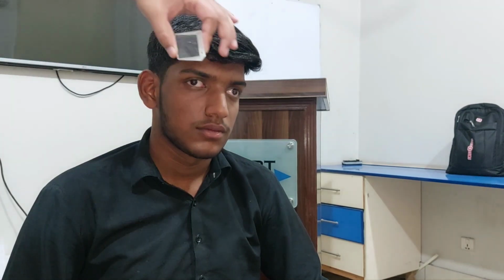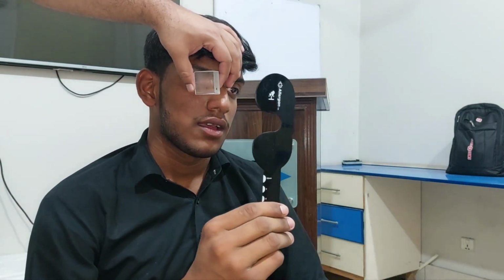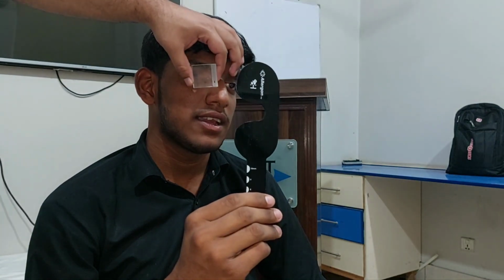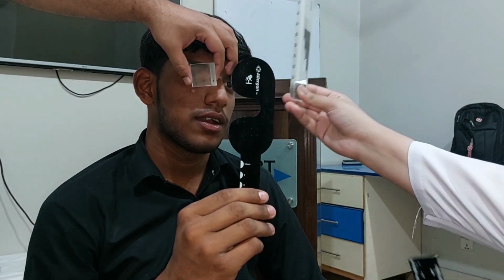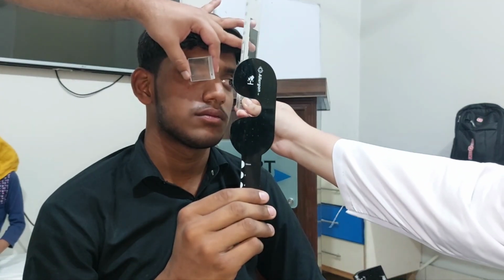Okay, so you will use a loose prism in front of one eye. So the direction is such that the apex is towards the direction of the deviation, and the prism bar is held.